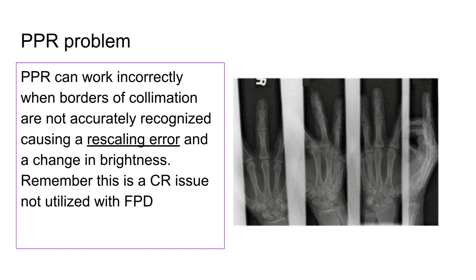So scaling is the process of creating the optimal contrast. We've talked about scale, long scale, short scale. When you choose a part, the lookup table histogram has a particular contrast in mind, a particular scale of contrast. But things can get messed up, and this process known as rescaling, which is assessing your contrast and changing it to the optimal contrast, might not work correctly.